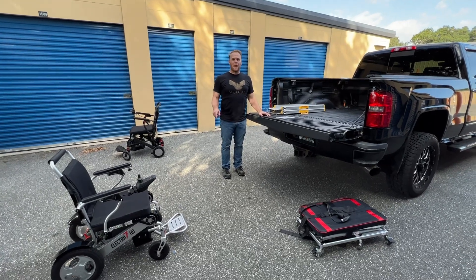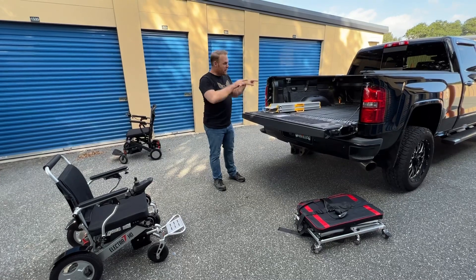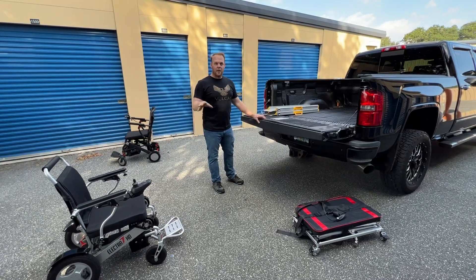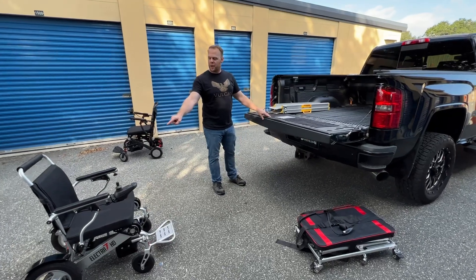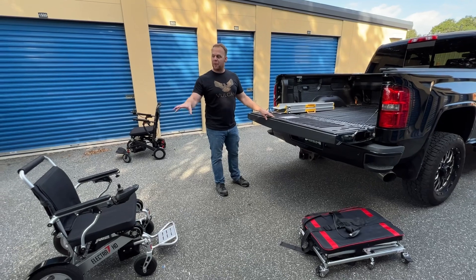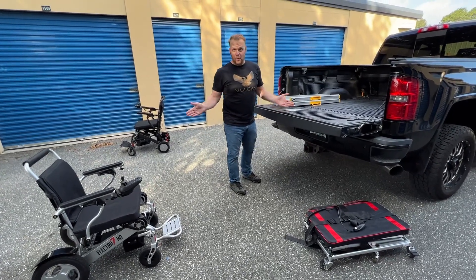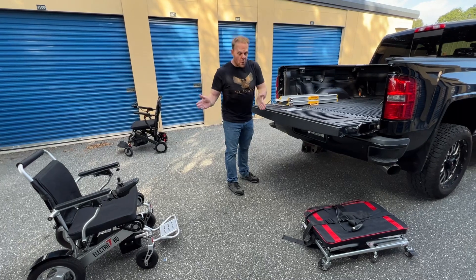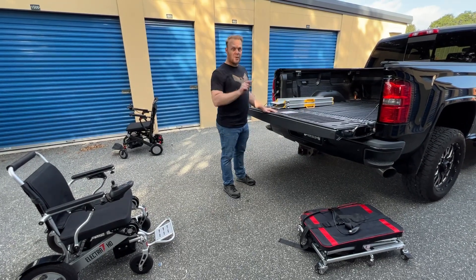Hello, this is Paul from QuickenMobile.com. In this video, we're going to put this Electra 7 power foldable wheelchair into the back of a truck. In a previous video, we did unloading from a truck. The Electra 7 weighs only 50 pounds without the batteries, 58 pounds with both batteries. We're going to do two loading methods.